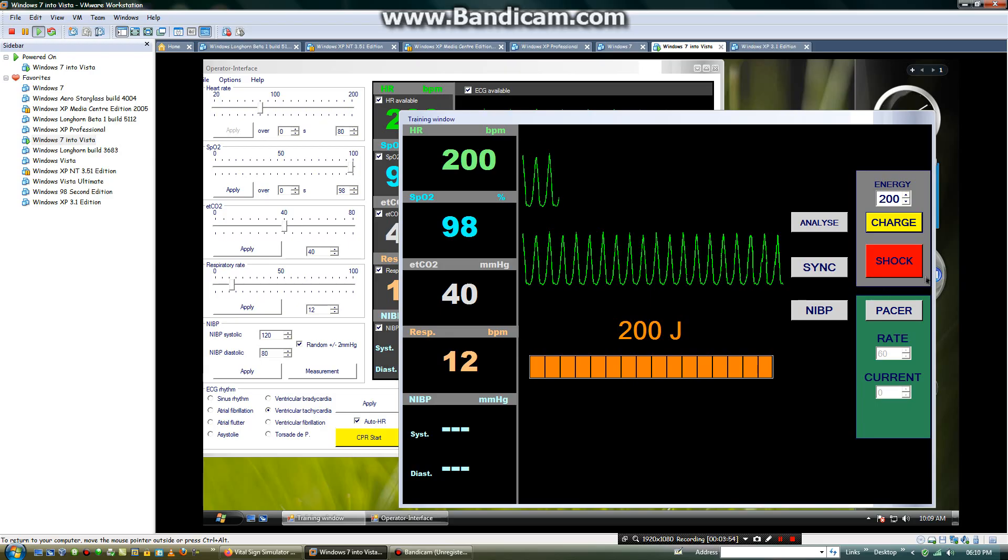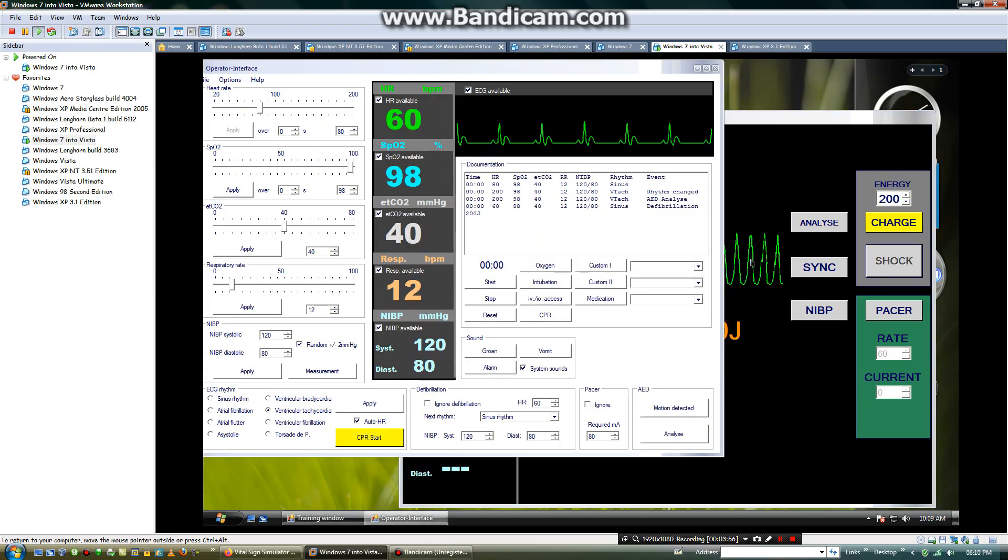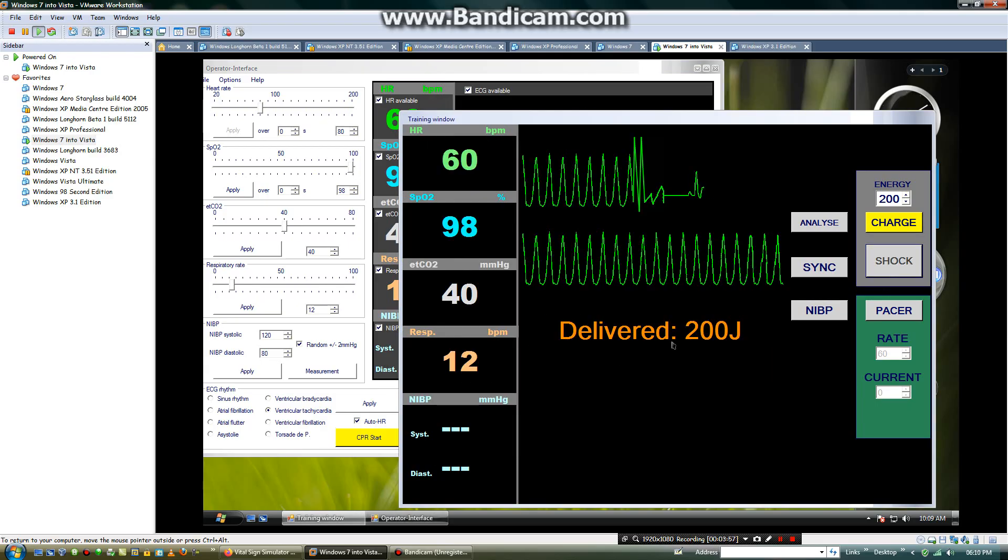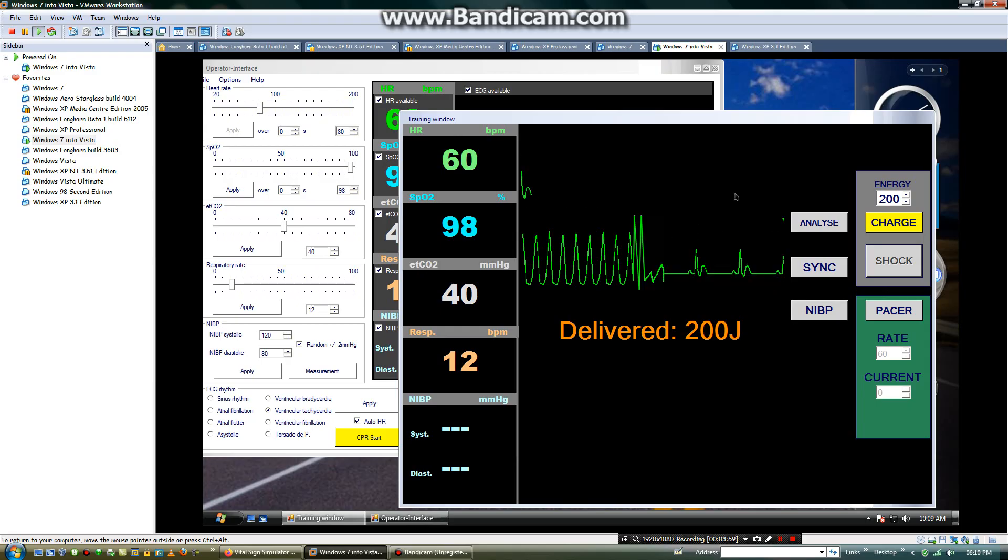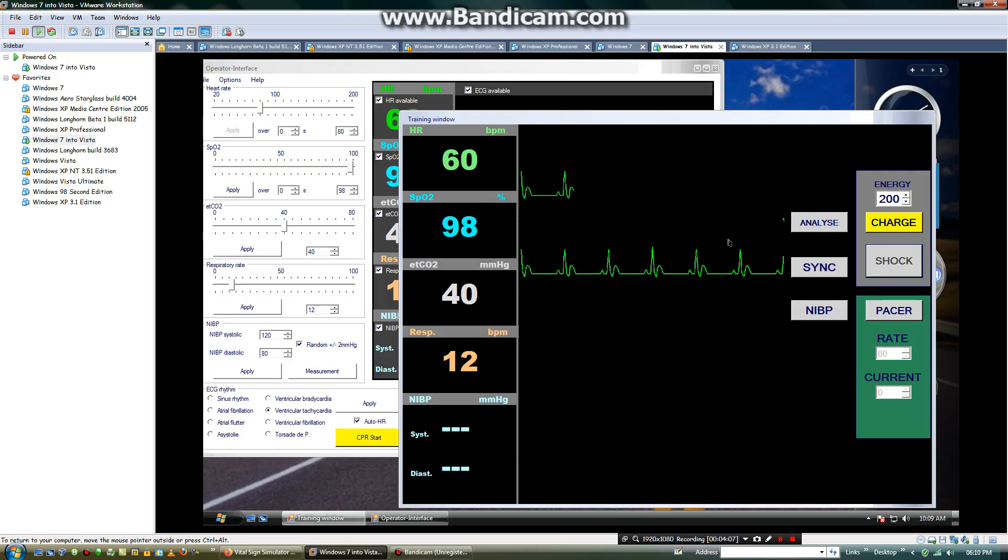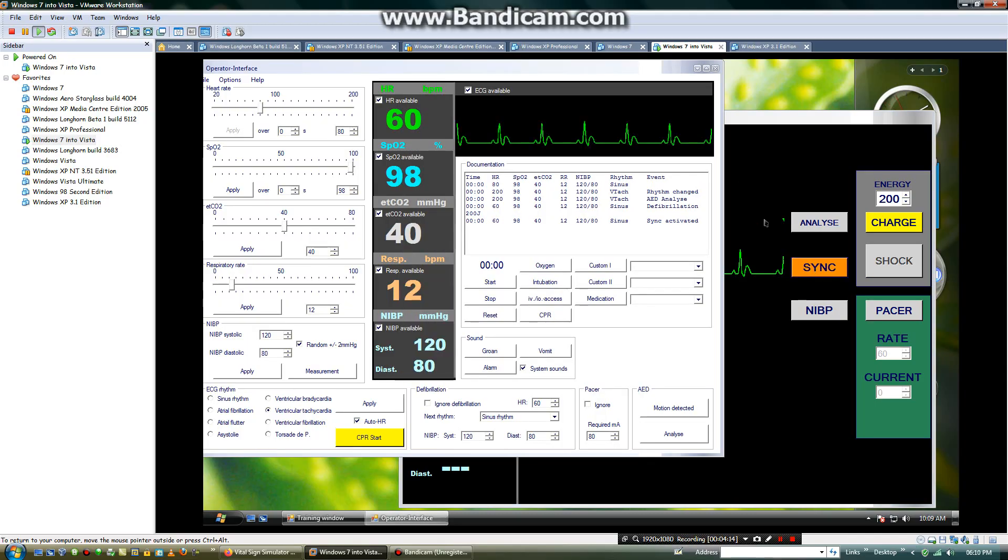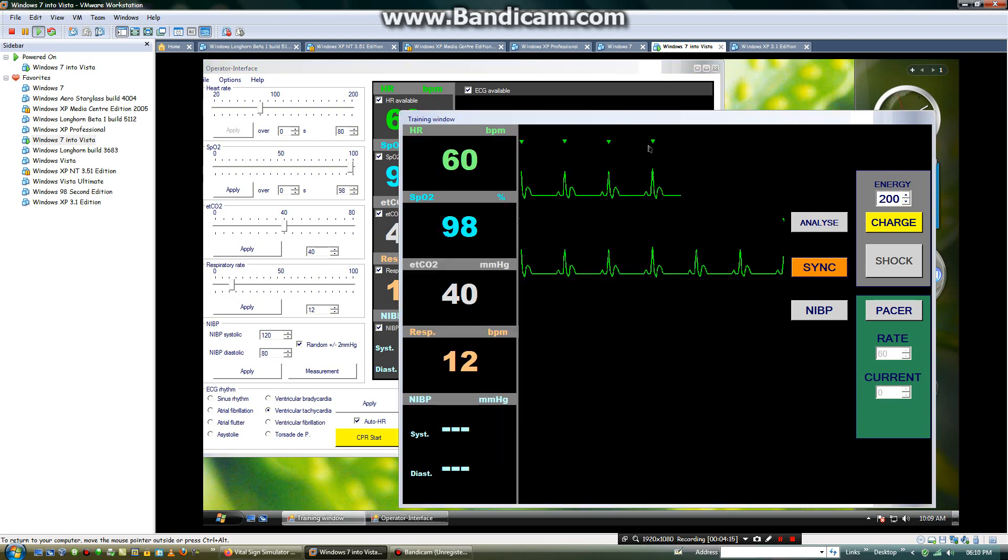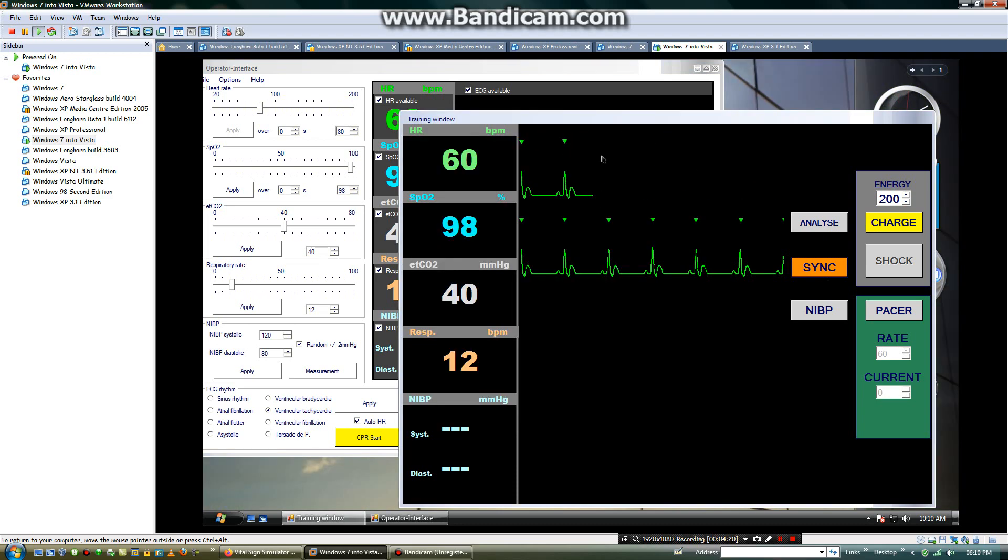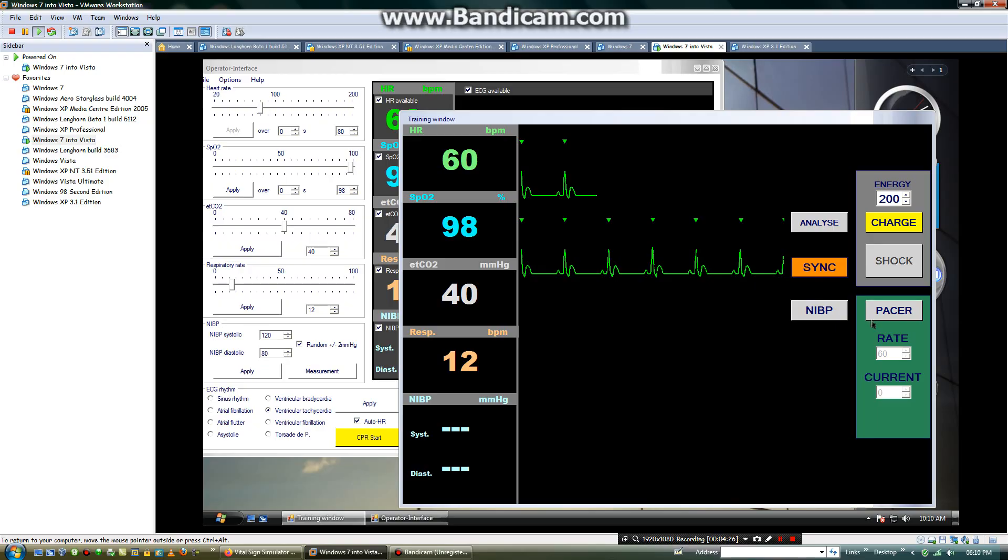The EKG rhythm. Then, it will bring the rhythm back to sinus rhythm. You can also sync the ECG rhythm to automatically put the marker on top of the QRS complex. You can see this is the QRS complex.